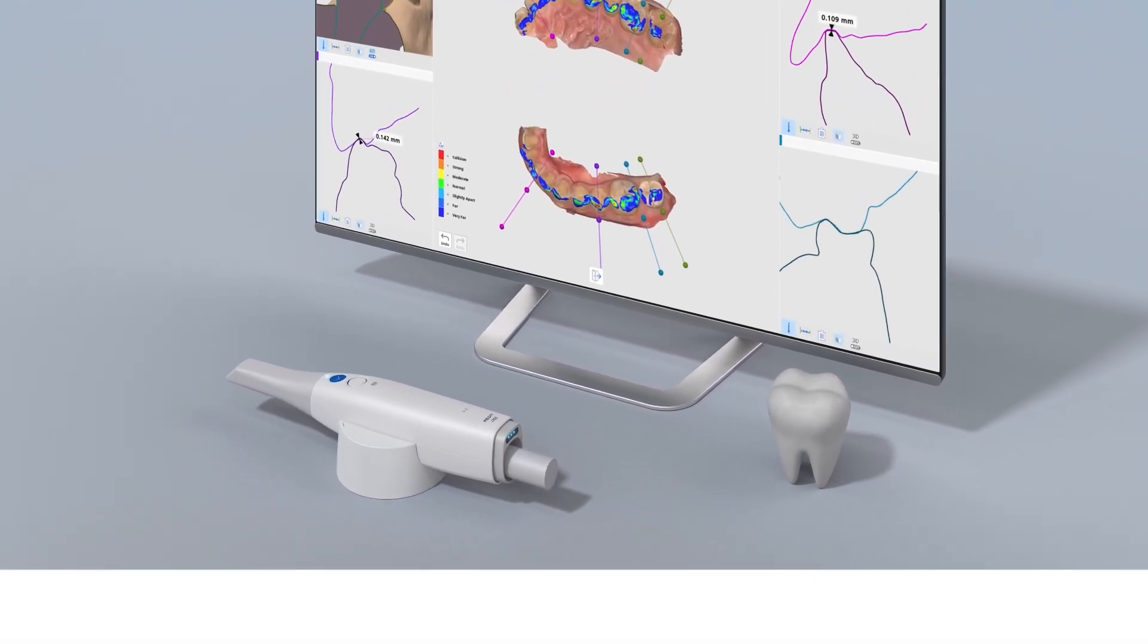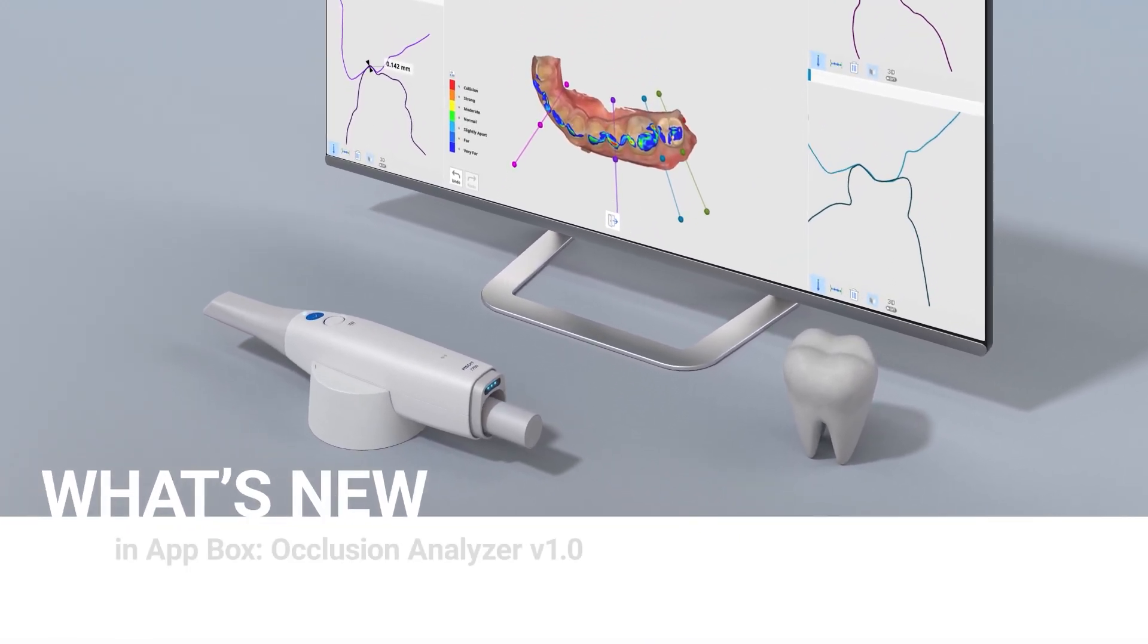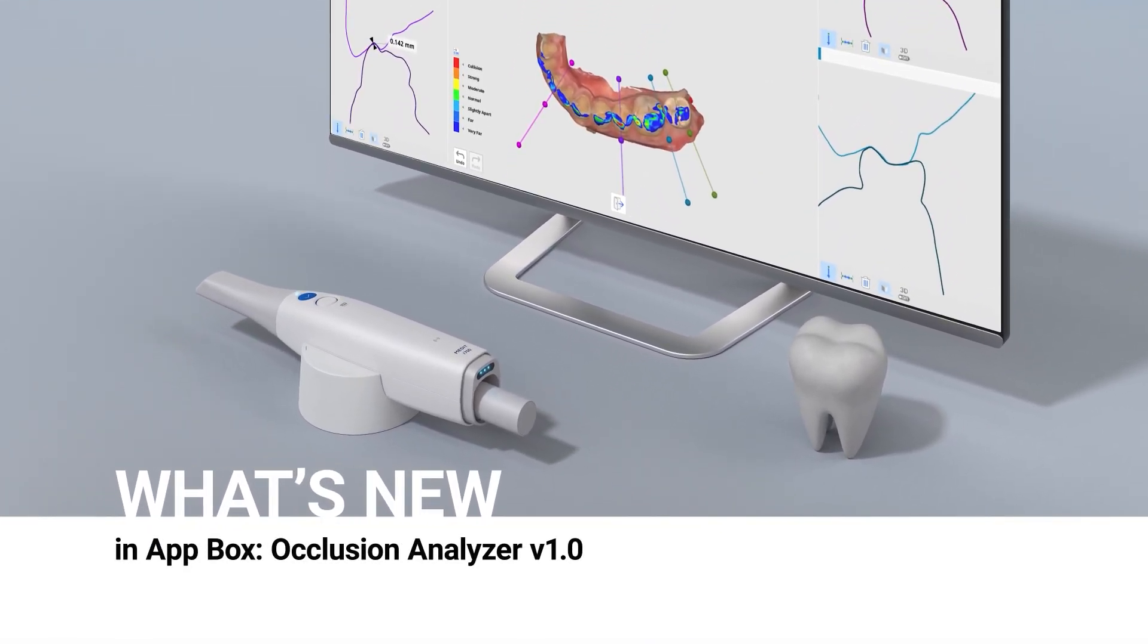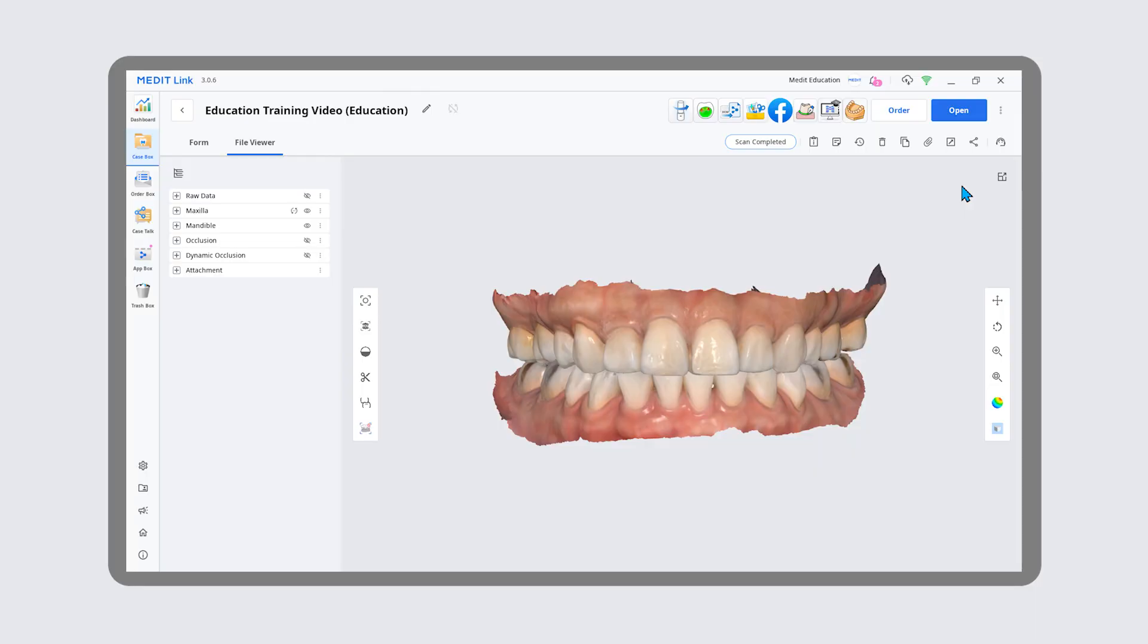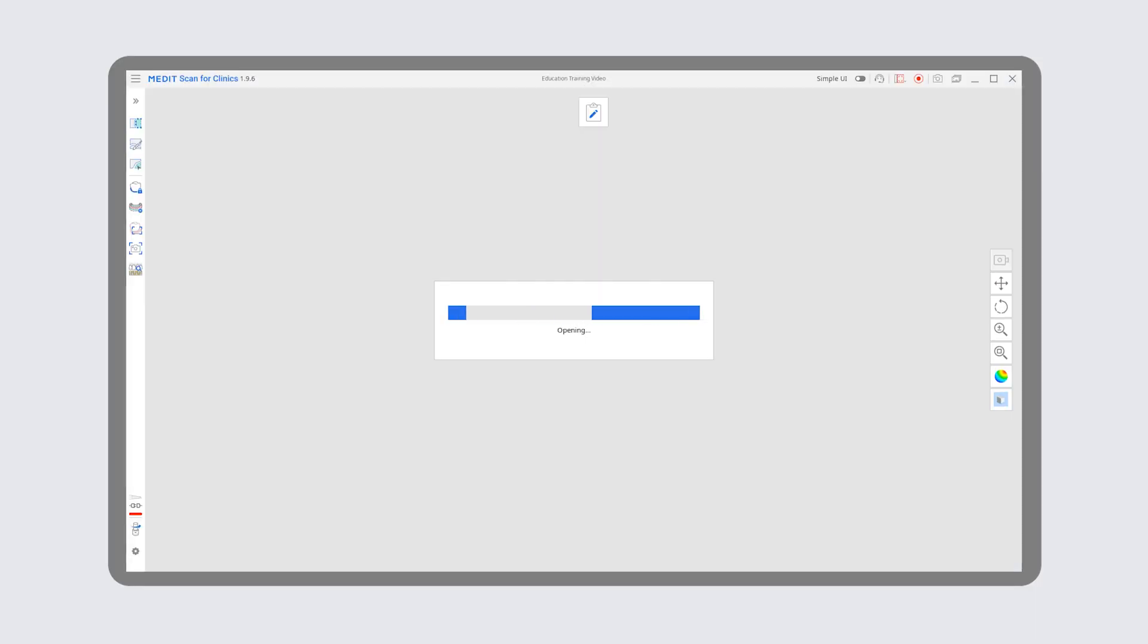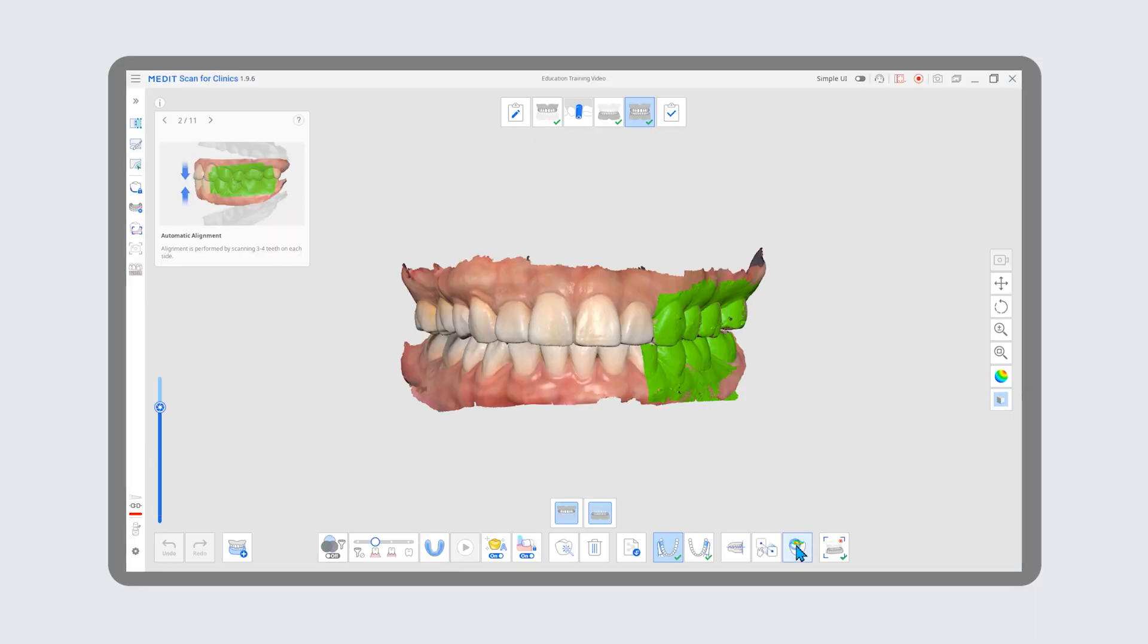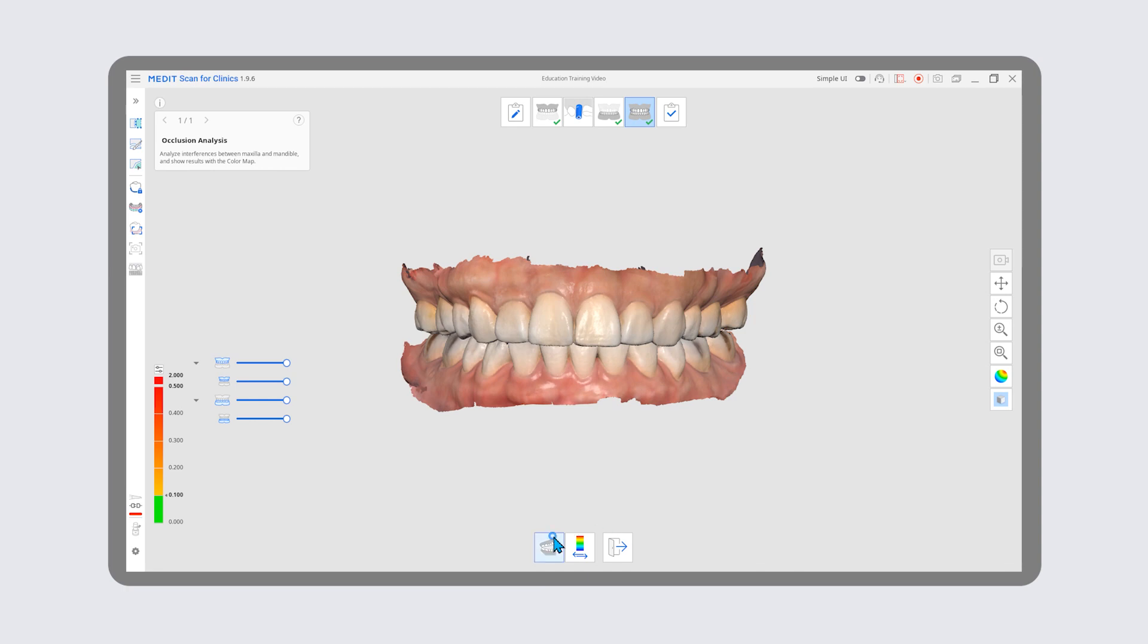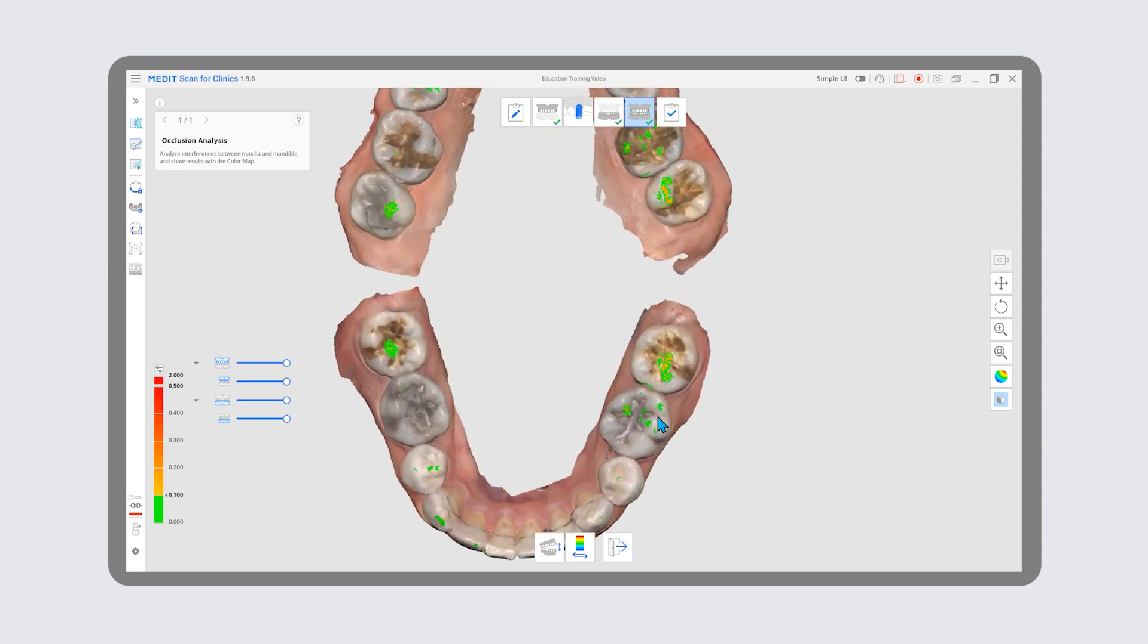We're introducing our brand new Medit Occlusion Analyzer app. With the new app, you no longer need to reopen MeditScan for clinics just to examine the bite.